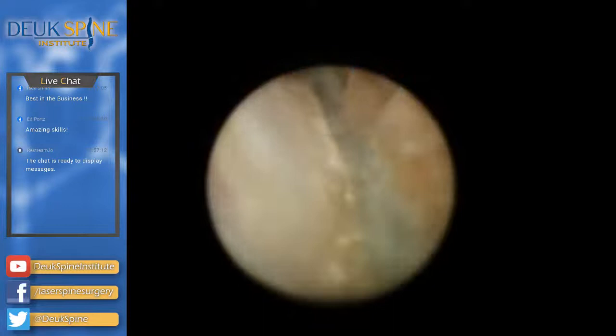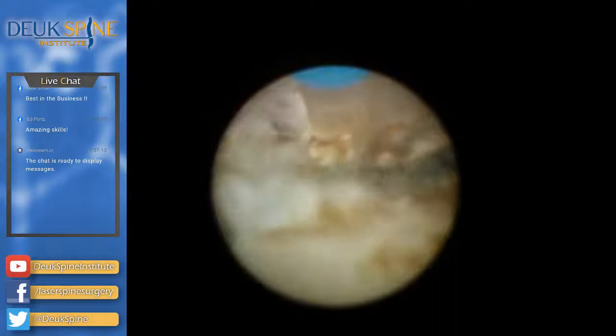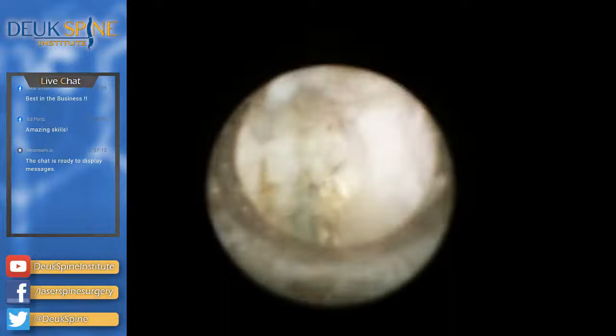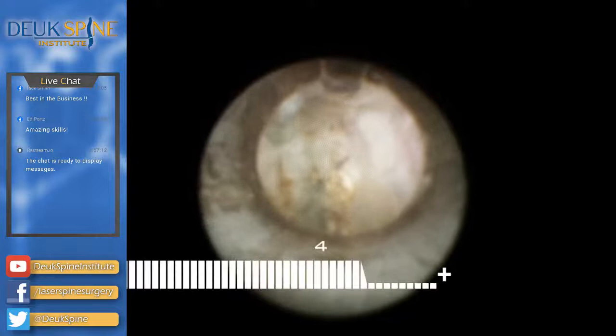Let's go. Pretty extensive damage here in the back of this disc. That's what we're seeing, a lot of damaged disc. I'm gonna try to improve our visibility a little bit. Let me see if I can zoom in. No, we're already zoomed in. Let me see if I can improve. There we go, it's a little better.